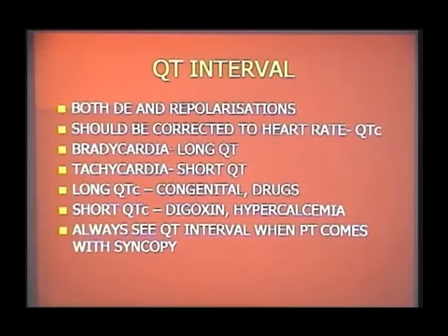The importance of QT interval is that whenever a young person or child comes with syncopal attacks and also fits, don't always think it is epilepsy. Many times it may be due to long QT syndromes, which produce dangerous recurrent ventricular arrhythmias and Stokes-Adams attacks, which will be the cause of syncope and fits in children. In children and young adults, whenever there are fits and syncope, look at the QT interval, whether it is long and whether it is producing a dangerous arrhythmia. Many times, the majority of these long QT syndromes are treated as epilepsy without looking at the ECG and the QT interval. So always remember that.